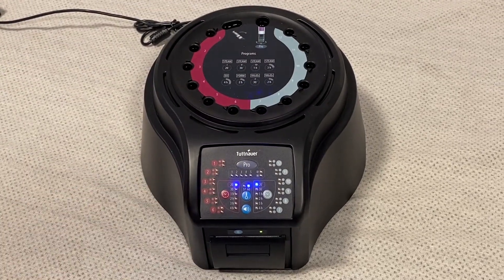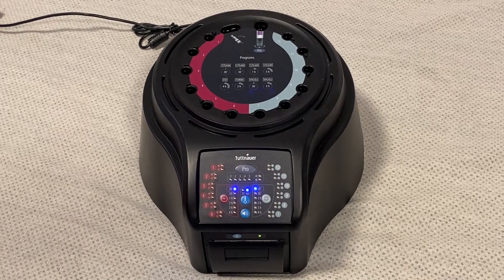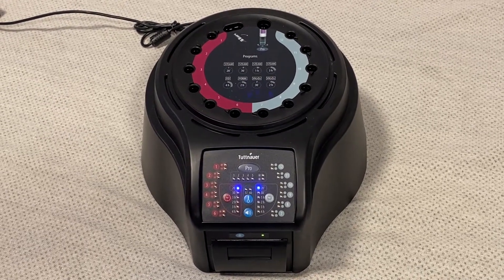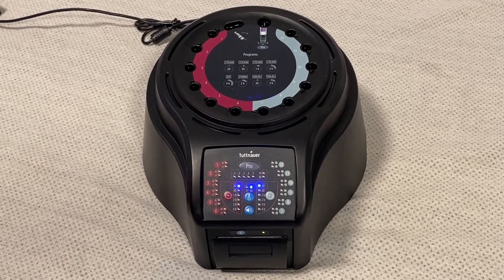This machine is capable of running 37°C or 60°C. 60°C is your standard for any steam sterilized indicator, where 37°C would be more standard for an ethylene oxide indicator.